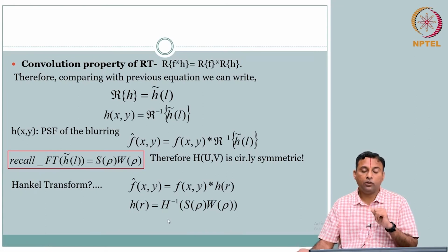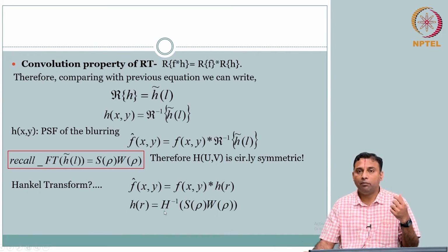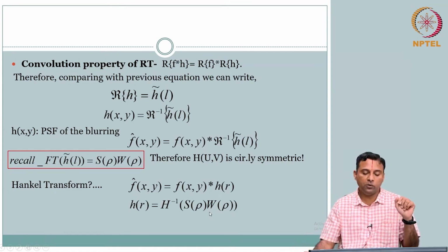Clear? So fantastic. Resolution, we talked about, can always be modeled as a blur function, and this is how the two practical constraints of what you are designing enter the blurring: your detector size or detector response, and the window function that you are operating. These are things that you could play with when you implement it, right?